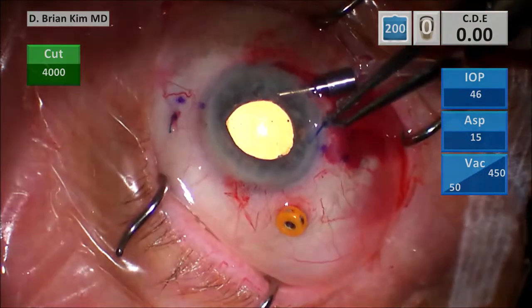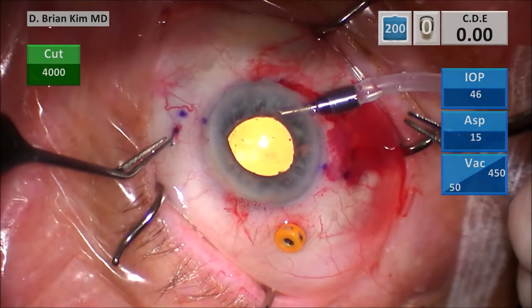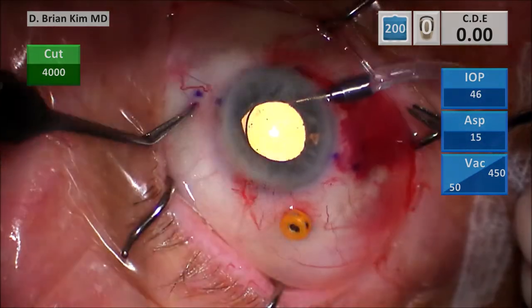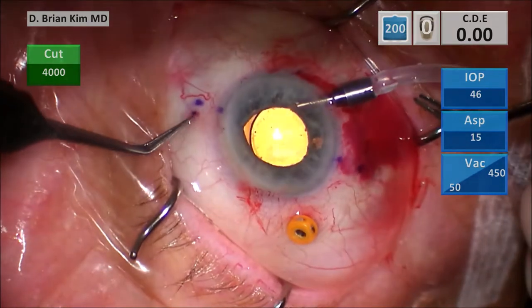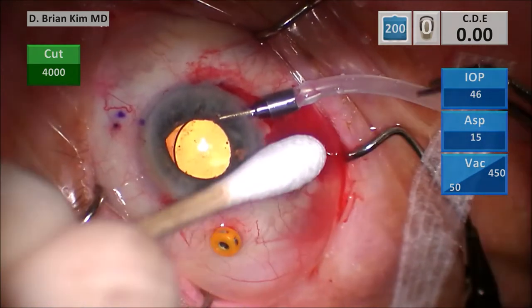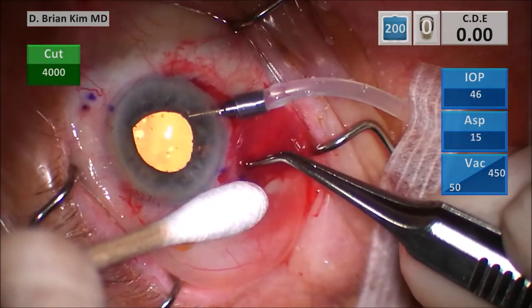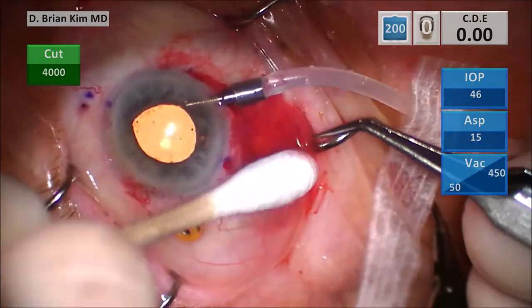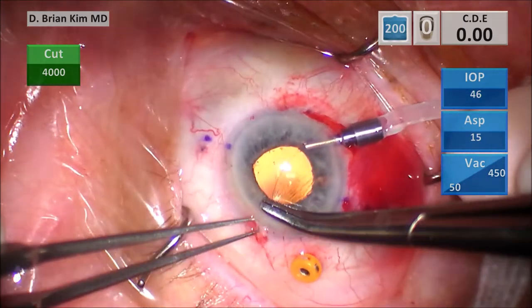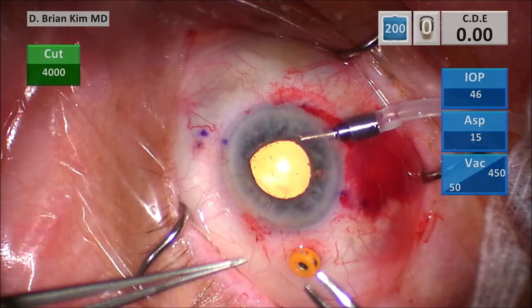The hooks are out — I'm going to push the haptics flush to the sclera, re-approximating the conjunctiva, and doing the same thing on the right side as well. There's heme there, so I'm using a cotton tip to help my visibility, then push it flush. This is a 10-0 nylon suture — I always close the main incision when doing these cases, just in case vitreous wants to come forward. I like to have a nice closed system.